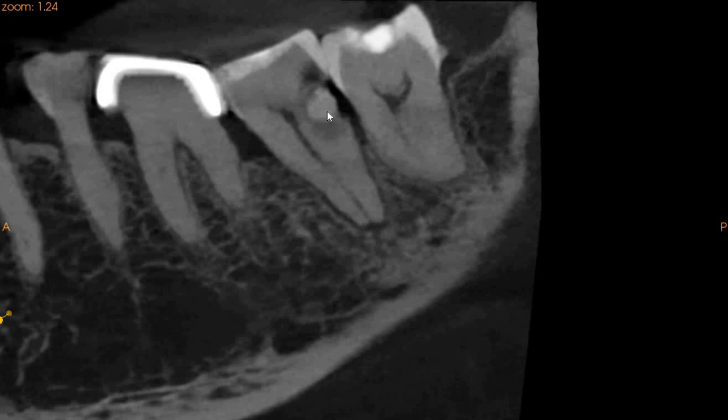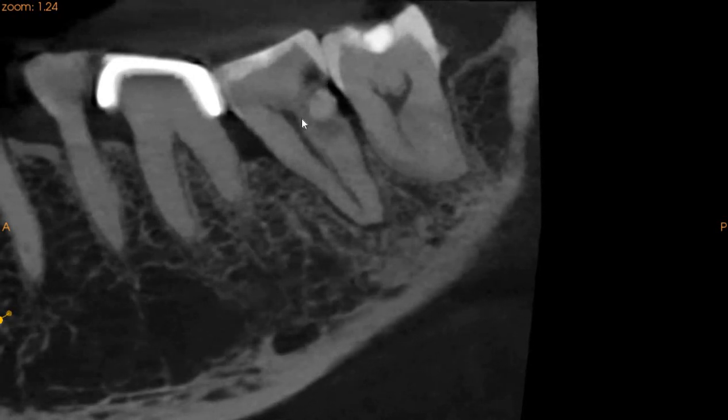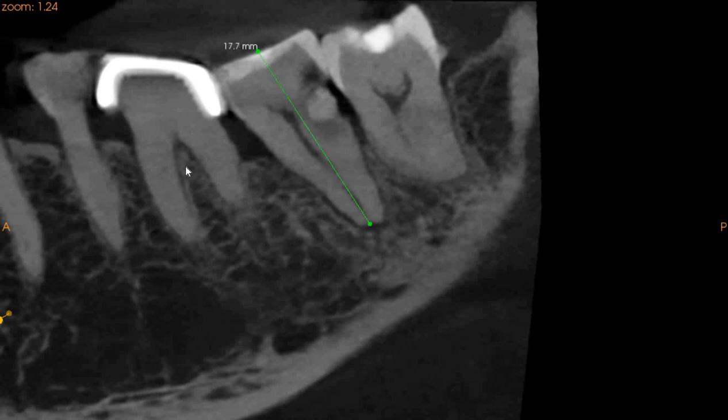This part, because there is bone loss, the cavity is definitely not subcrestal, but definitely will be subgingival. We've got a temporary filling material, I'm presuming, on the distal aspect as well. This cavity is definitely invading the pulp space. A rough estimate of the working length for this tooth is going to be 17.7 millimeters, or we can make this 18 millimeters. We've got one single canal.